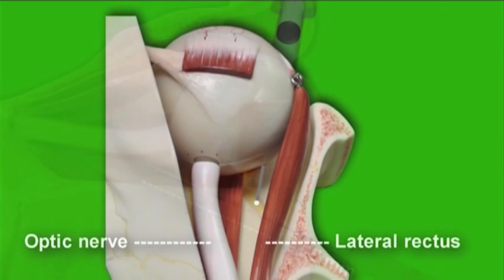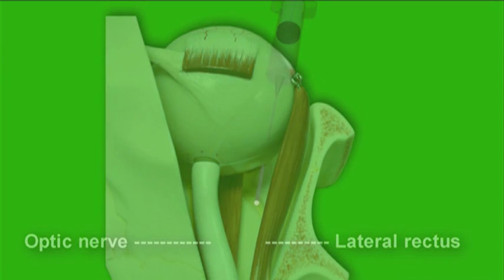At this point in stage 3, we observe the final needle tip resting position. The needle tip is safely located posterior to the globe in the lateral limbic plane between the lateral rectus muscle and the optic nerve. We can further envision from the earlier anatomical demonstration how the optic nerve, macula, and primary neurovascular structures remain medial to the needle tip. In addition, the lacrimal neurovascular structures are located superior to the needle tip.